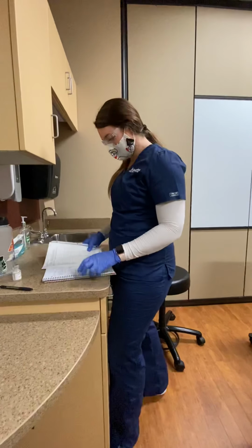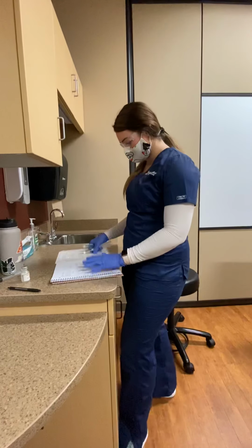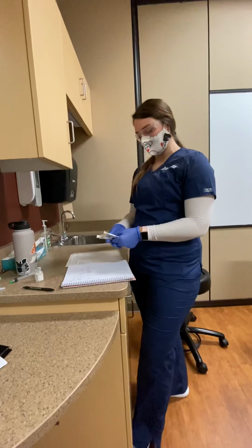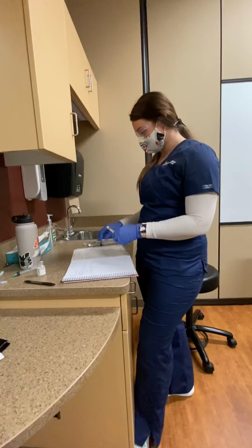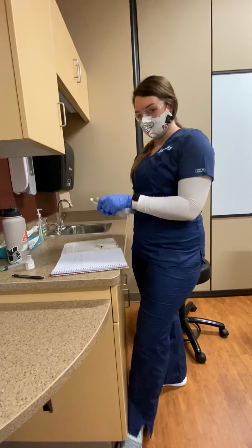Right, so I have Mary Smith. She was nauseated, so the doctor ordered Zofran, so we have an order for that. So I gathered my supplies. I'm going to need 3 10 milliliter syringes of normal saline. I'm going to check the expiration date. They're not expired.